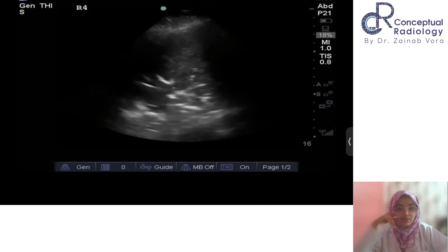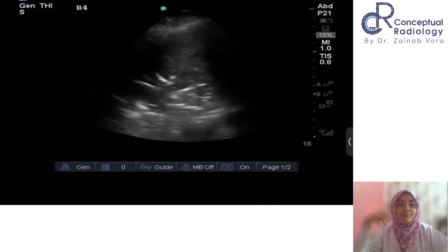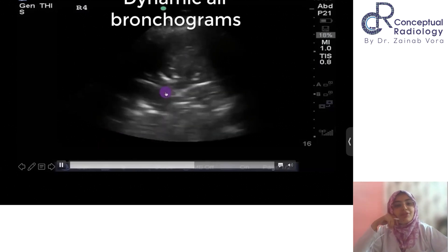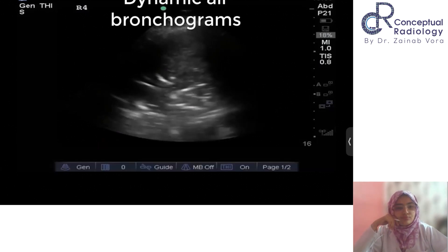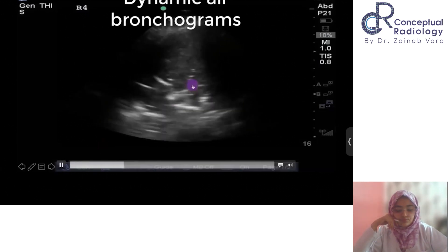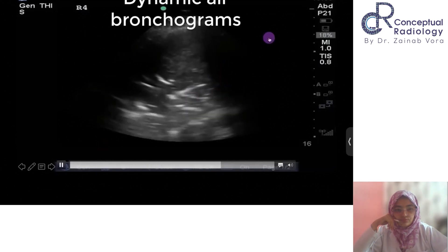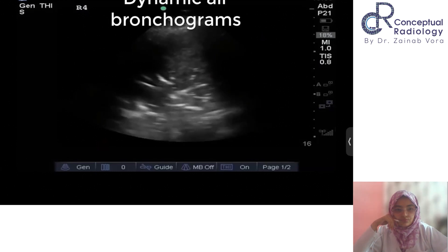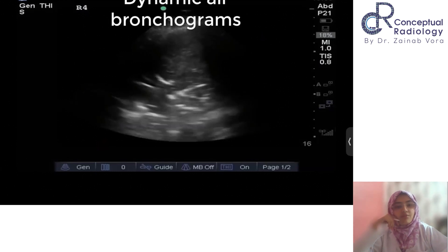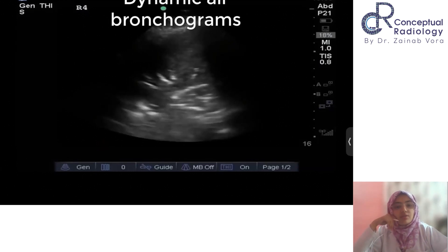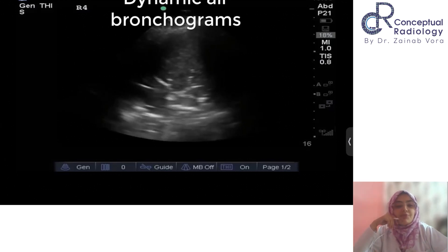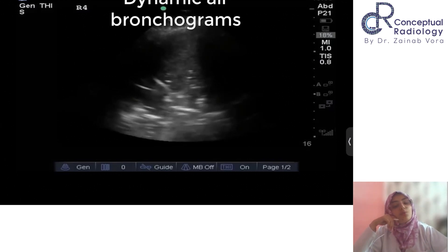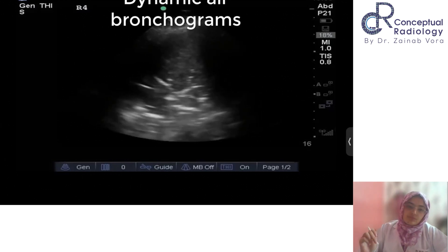Now you see how the air is coming and going — small air bubbles move to and fro with every breathing, causing the air in the bronchi to move with inspiration and expiration. They have a flowing quality — air is flowing within these airways, confirming a patent airway. This is the dynamic air bronchogram, which is usually seen in an infectious setting, and not in the case of an obstructive setting.